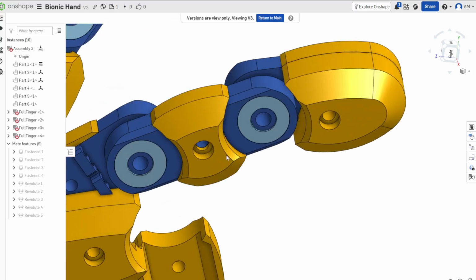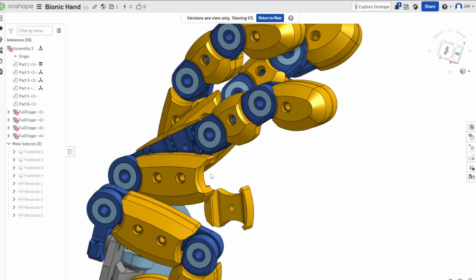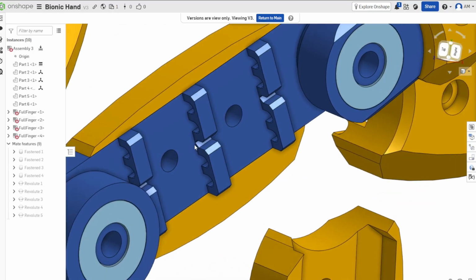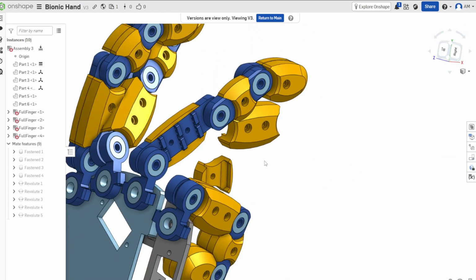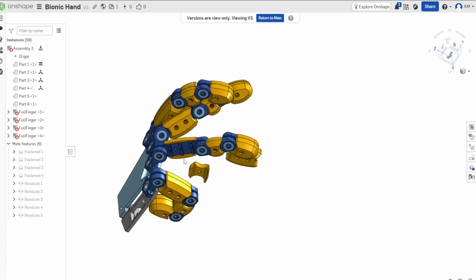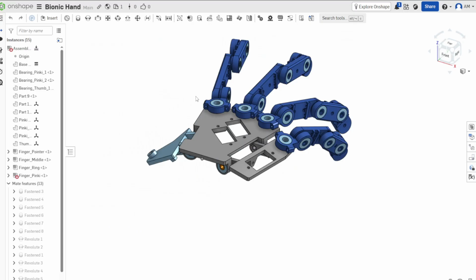Plus, the way these are set up is they're modular, so you can design your own. Just take them off. Maybe these ones come off because they're broke, but yeah, rip them off, and now you just have bare bones, run it with the skeleton, or make your own design. Maybe add extra grip, no grip, make them thinner, thicker, whatever you want. So let me hop back to the main model, and I've been revamping it.